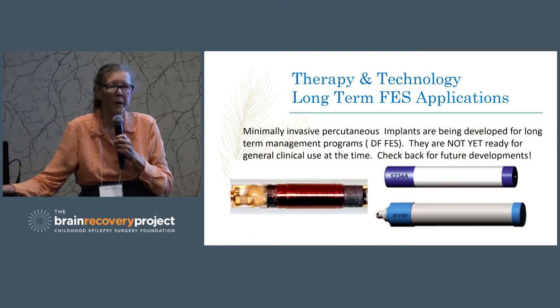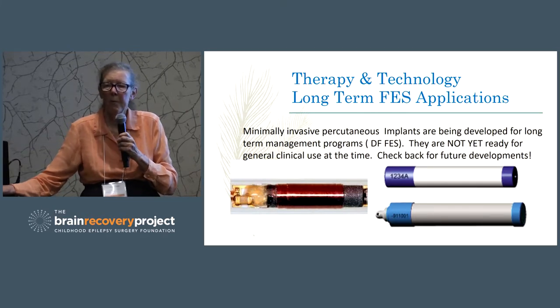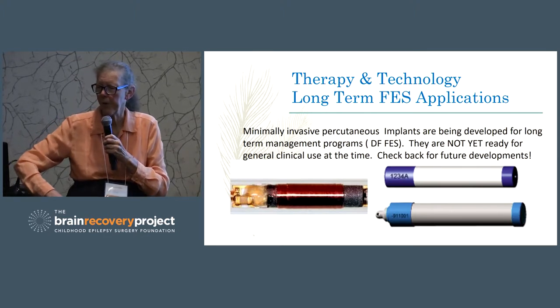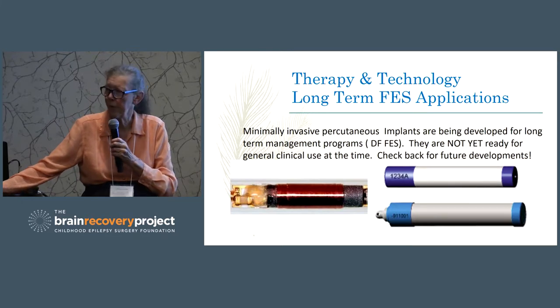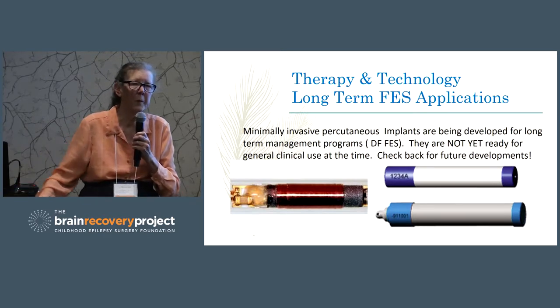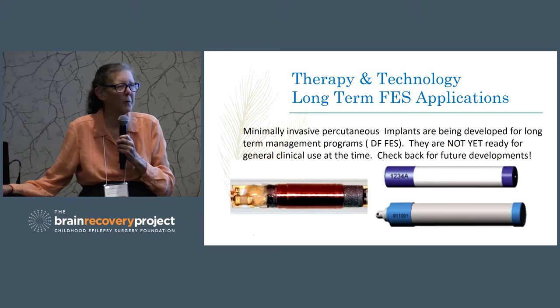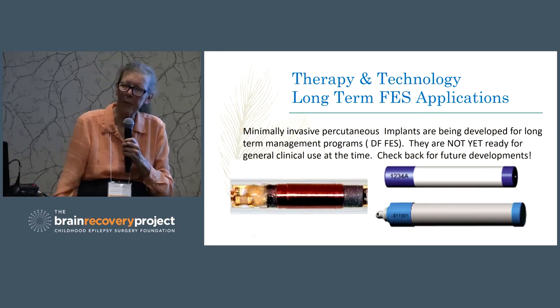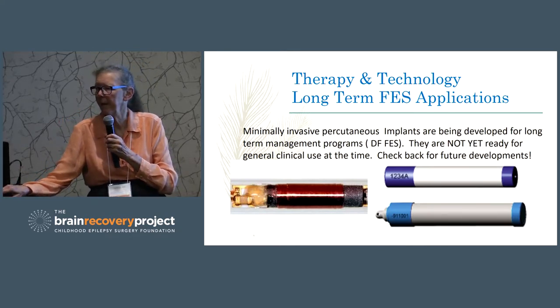Okay, now in some of your upper, we haven't used it in the upper extremities, at least as far as I know, nobody's used it in the upper extremities, but some of this shoulder abduction that your children have along with their flexion, this is something that could be developed into an orthotic treatment that would just be basically continuously on. Get up in the morning, turn it on, it allows them to relax their hand a little better, and then we would make it either so that it wasn't so strong that they couldn't break through it to do a biceps contraction if they wanted to, but they can have a more relaxed posture through the whole day. Okay, so these are some things that are in the offing that we can expect to see in the fairly near future.